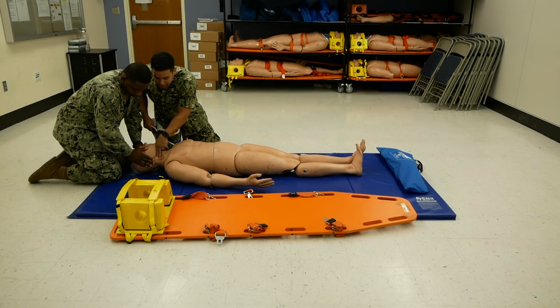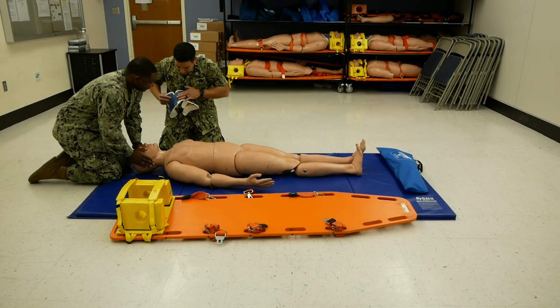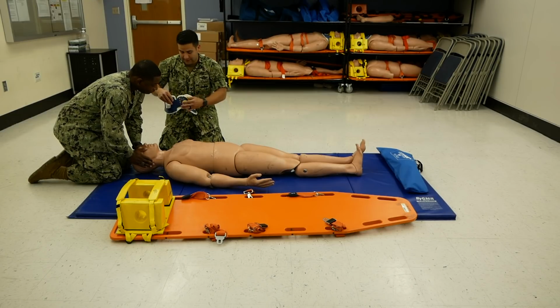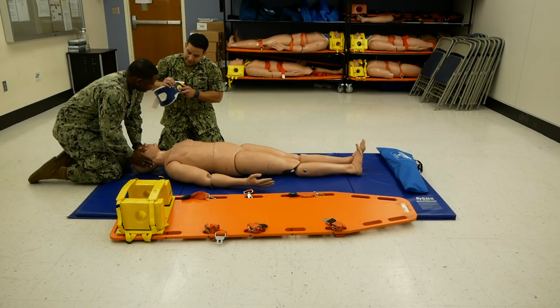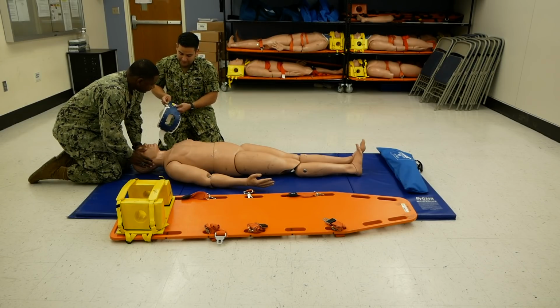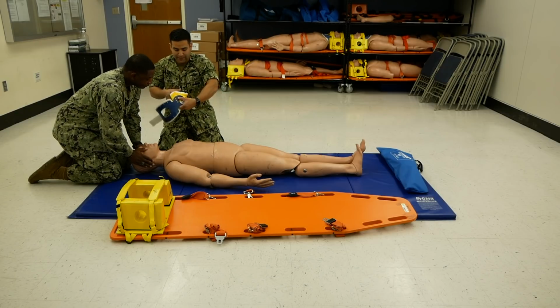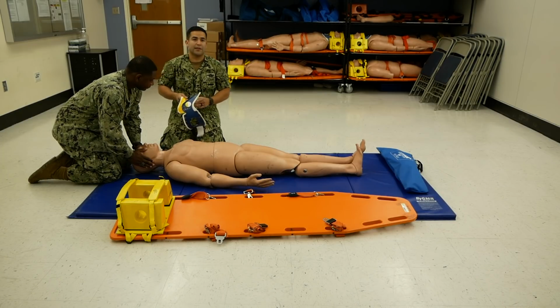You will take your hand, place it on their trap to the bottom of the mandible, right here. It appears to be about 3 fingers in width. I place that on the C-collar. The last hole that my top finger covers will be the placement of the tab indicating the size. It went to the 3rd hole. I go ahead and unlock. Slide the indicator up to that 3rd hole that I covered, and then lock it back in place. Do the same for the other side. Unlock, slide up to the 3rd hole, and then lock in place.